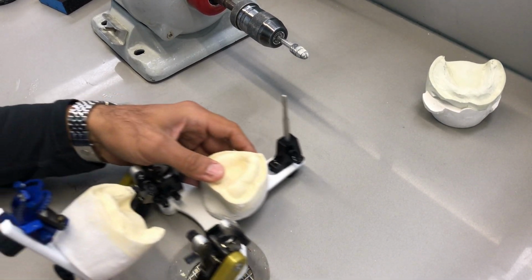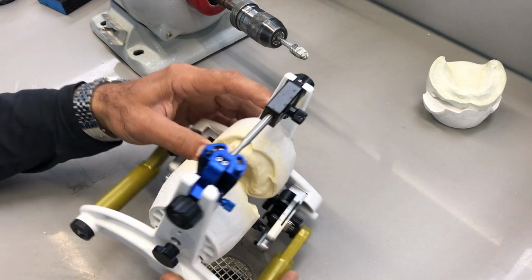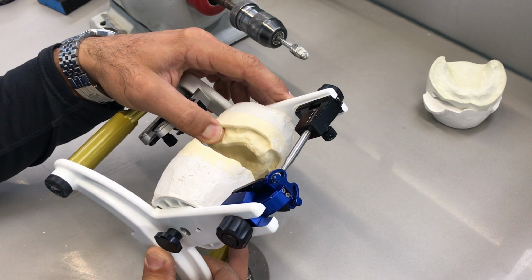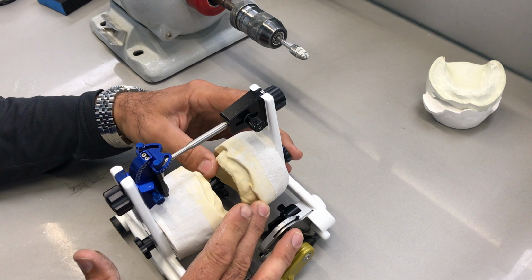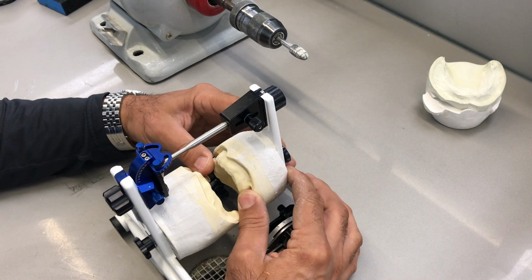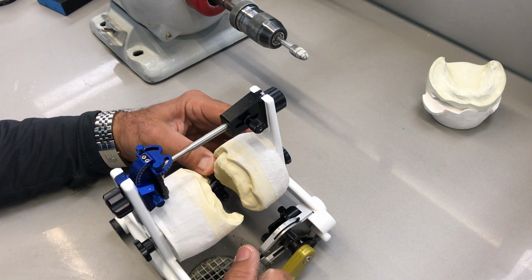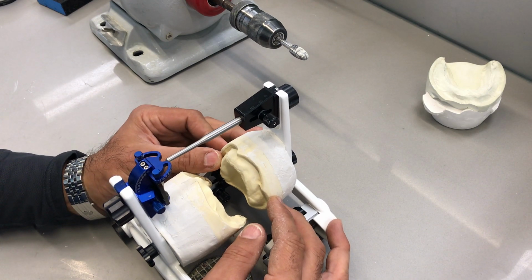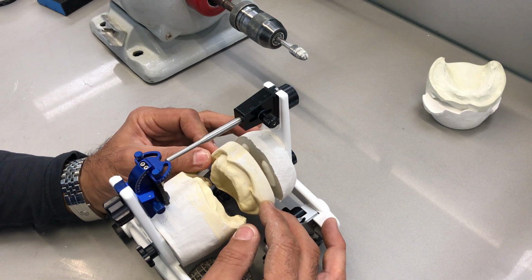So when you finish with your mountings, you should have something like this, right? Models are secured up against the plaster mounting. And any wax that we had to seal the models to the bite that we used previously, we boiled it off. What will happen often is that some of these models might come off the mounting. So if you notice the upper one here, even though it looks like it's sitting in place, it's actually snapped off, which is okay. It'll happen.